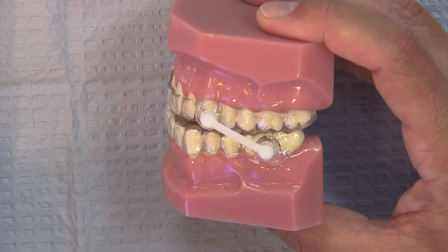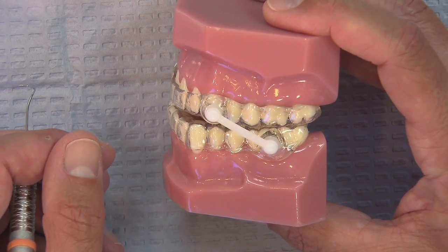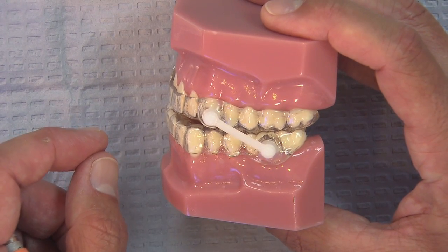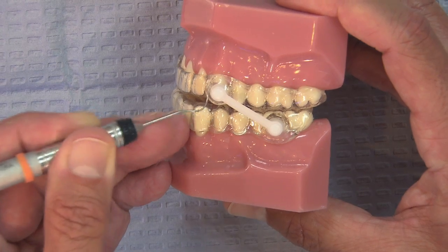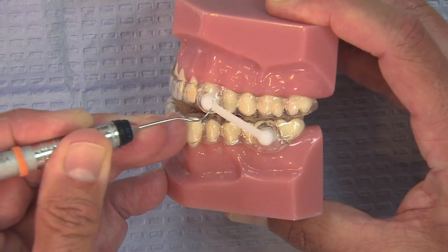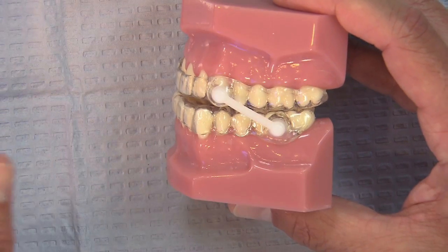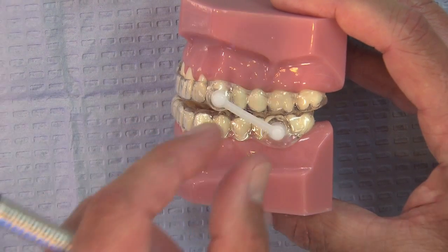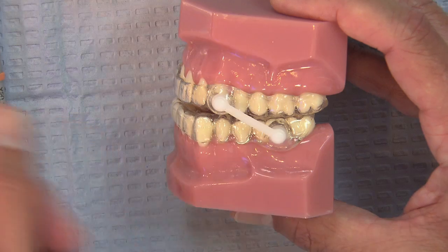And when there was a time for a change to be made, for example, if you delivered this to a patient and they were still snoring and you wanted to go to a shorter strap for some more anteriorization, they had to bring the appliance back to you, and you actually had to take a Bard-Parker knife and cut the tip off on both sides of the strap. So you'd have to cut this off and then cut off this side with a Bard-Parker knife, and then you would take the strap off. Then you had to assemble the little parts that were inside of the appliance, put a new shorter strap on, and then use a special pair of pliers to clip it back down again.